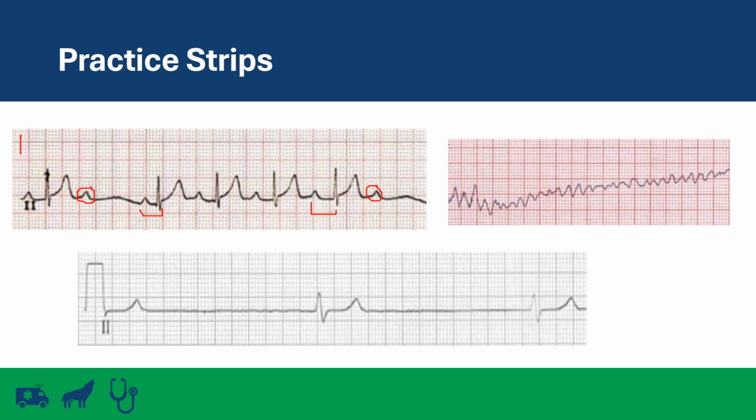All right, over here on strip 2, we've got completely sporadic heart activity. This is VFib. No need to look any further. This is VFib.